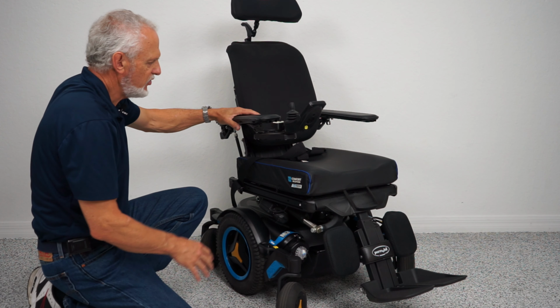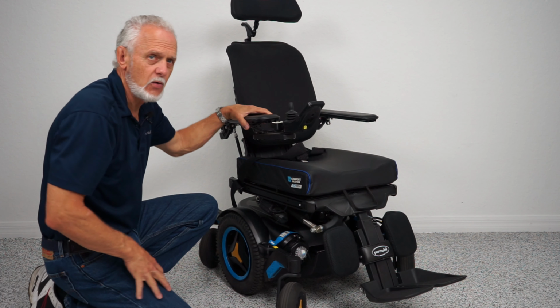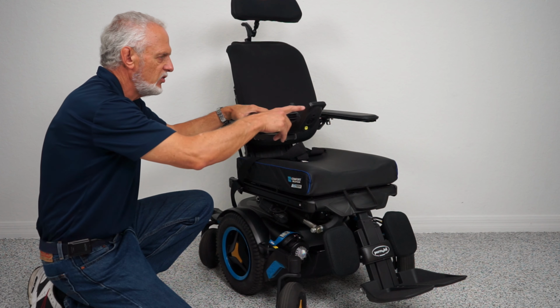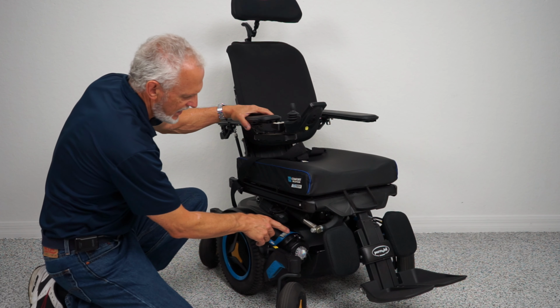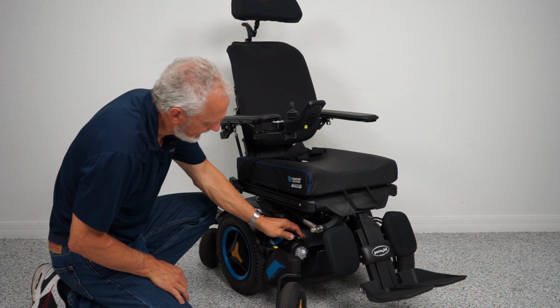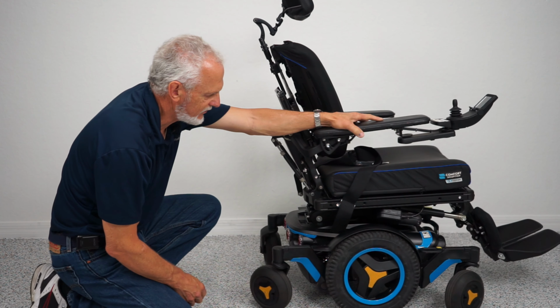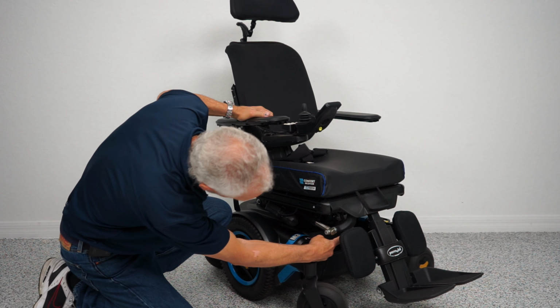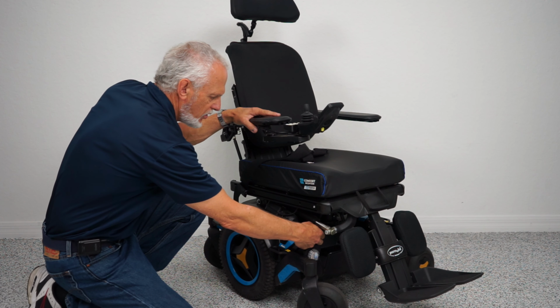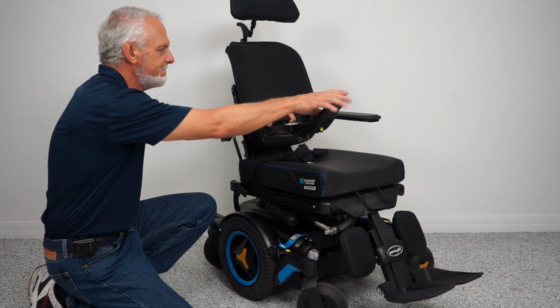If I want to put this chair in neutral and want to push it, well, you can see it weighs over 300 and some pounds. You have to put it in neutral first. So you would turn the power off. And right here on top of the motor, you can see with my finger, there's a little screw right there. That's a handle right there. If you push the handle inward, what that does, it unlocks the wheel. You have to do both motors because there's another motor on the other side with a reflector. When you're done pushing it around, make sure you put it back in gear. Many people forget to do that, then they call me.